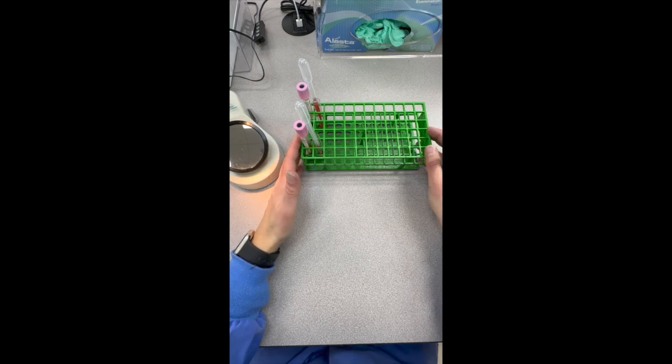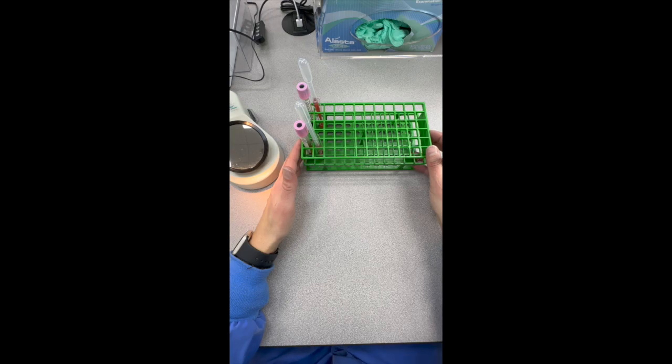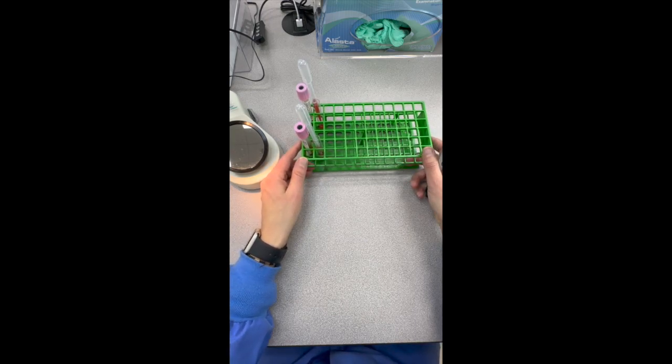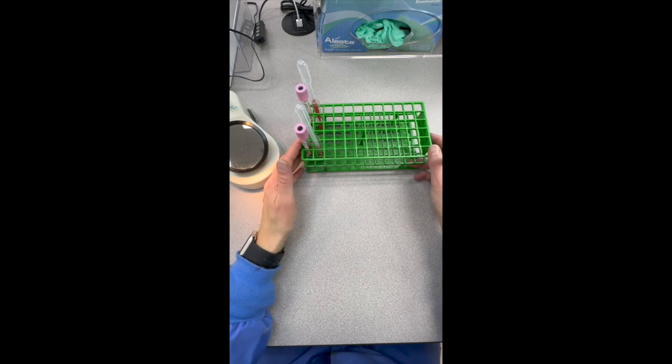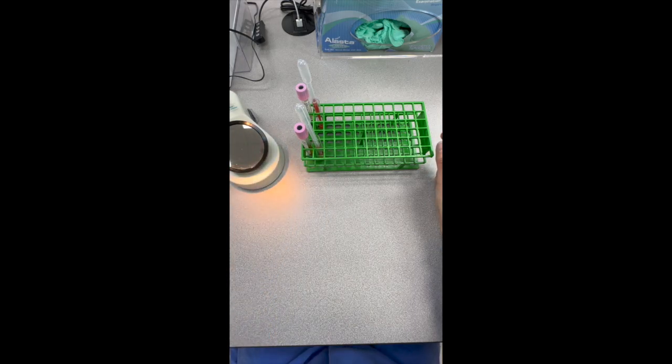You're not going to typically do it on a regular adult patient, on your daily work. Where you would perform it is on a baby, a newborn, a cord blood. It's important to do a DU there to determine whether the mother would need RhoGAM. And the other instance you would be doing a DU would be on donor units. If a donor unit is DU positive, that unit should be labeled positive.